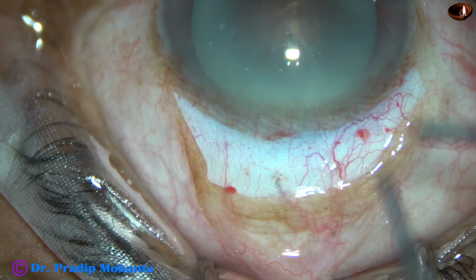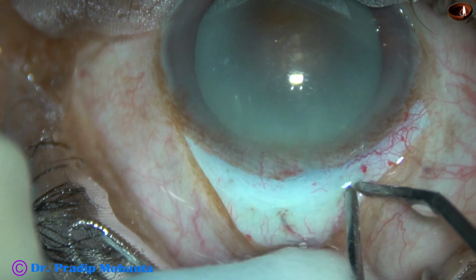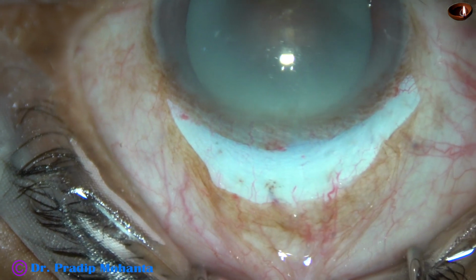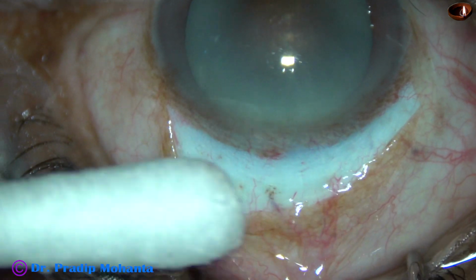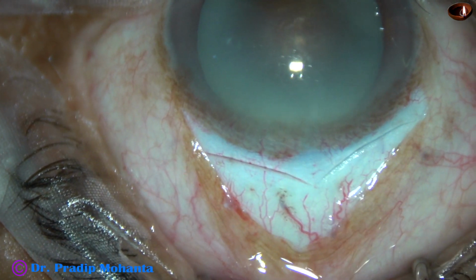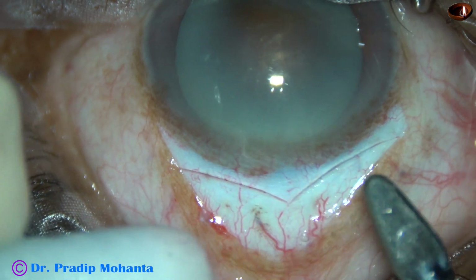By this time the peritomy has been done for about 4 clock hours, from 10 o'clock to 2 o'clock. In small incision cataract surgery we do peritomy for 2 clock hours, and this is for 4 clock hours because it is going to be a very large incision, about 11 millimeter, and the two SICS wounds will be joining at the middle. This is one SICS wound, and this is another SICS wound, and these two are joining at this point. So it has become like a V incision, a wide V incision.